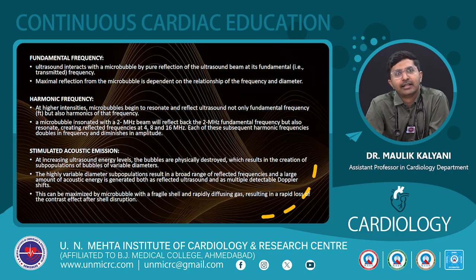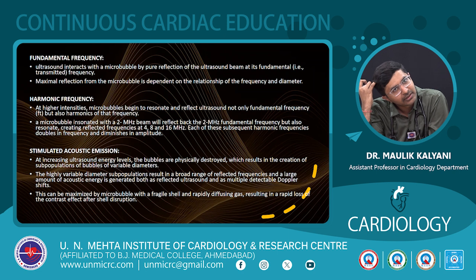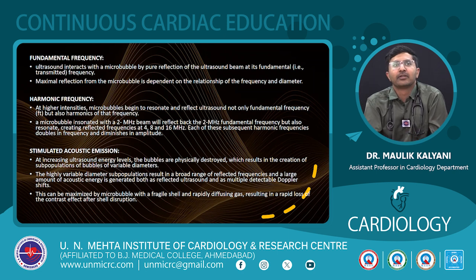Second is the harmonic frequency. With a higher intensity, the bubble will begin to resonate, and it will also transmit frequencies that are multiples of the baseline frequency. So from a 2 megahertz beam, it may also transmit 4, 8, and 16 megahertz. This is called harmonic frequency, and it increases the overall image quality.